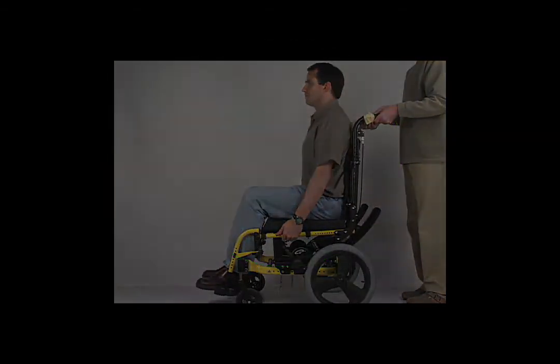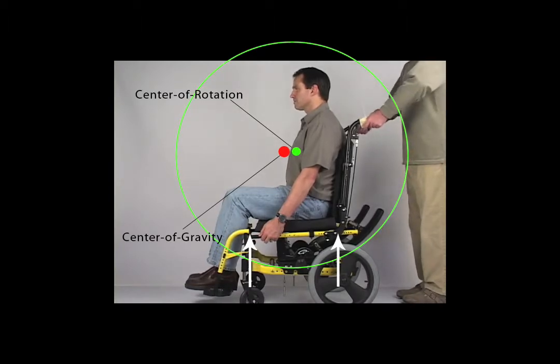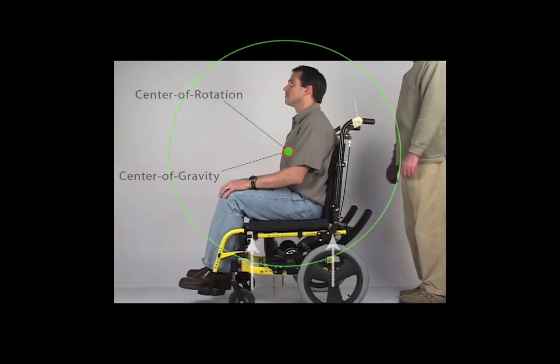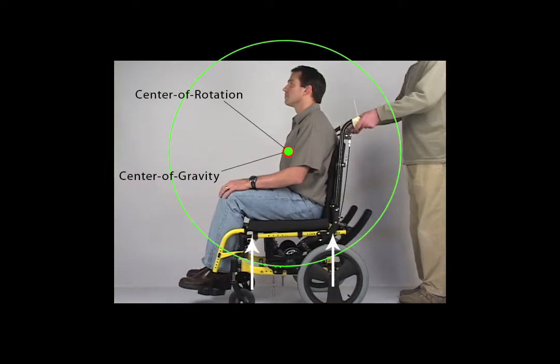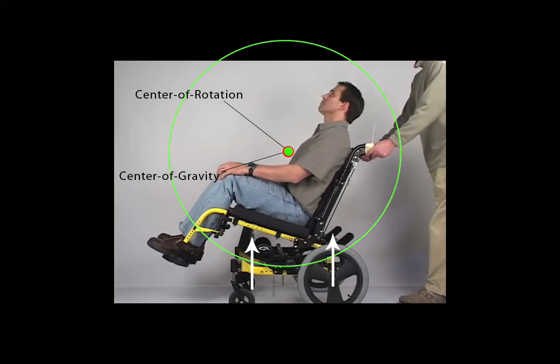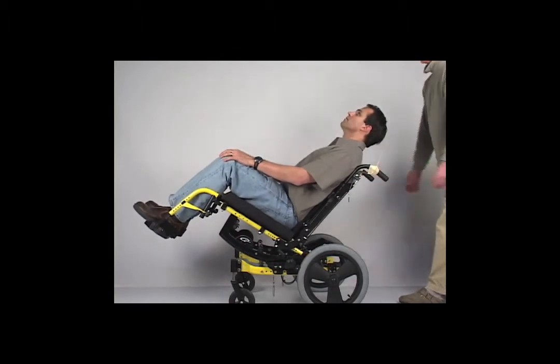In the next example, center of gravity will be in front of center of rotation. In this example, the chair will fall into the most upright position. But when the center of rotation and the center of gravity are properly aligned, the system can be left in any position with the pins disengaged and will be stable and not subject to rotation.